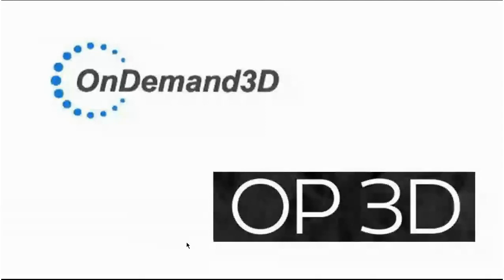Our intention is to support you with the fact that you have a really powerful tool on demand, and that we are able to do a lot of clinical assessments in general, or in this instance for implantology.